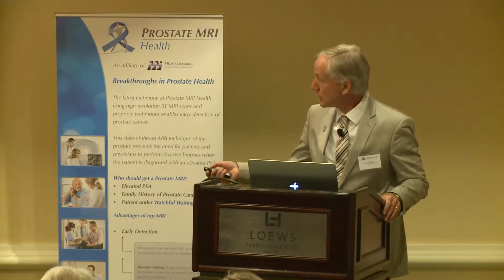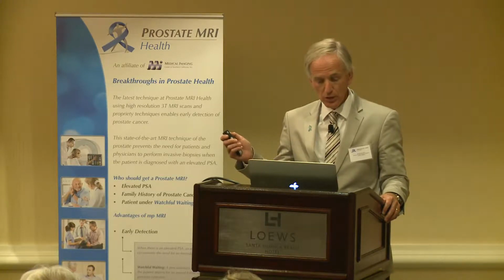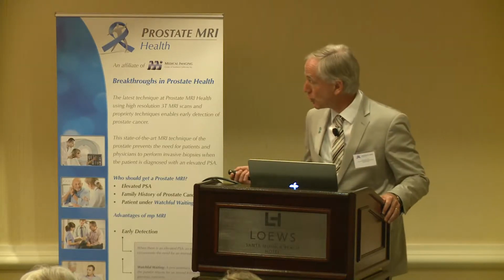We used to have a very complicated 2-hour MRI, endorectal coil spectroscopy. We don't want to have that. It should be simple and fast. No more than 30 minutes or even shorter. So no endorectal coil, no spectroscopy. A paradigm shift. The other thing is a paradigm shift between urology and radiology.